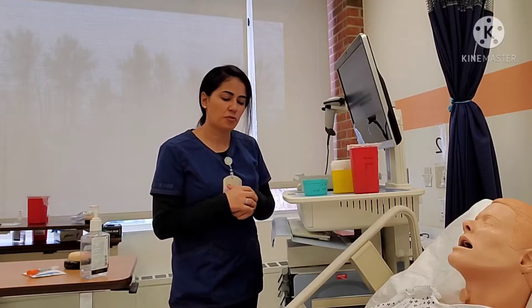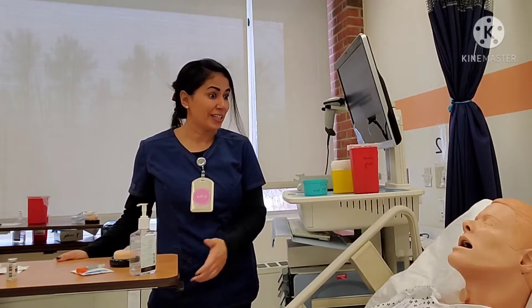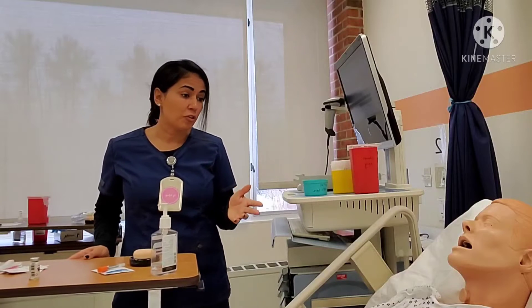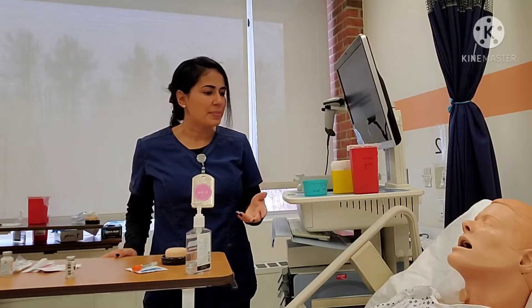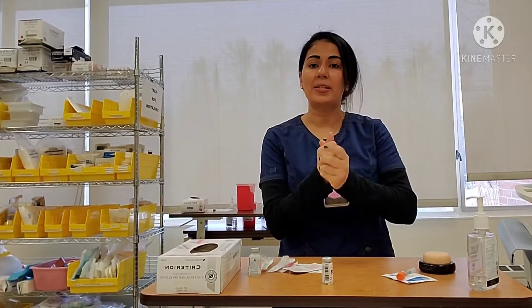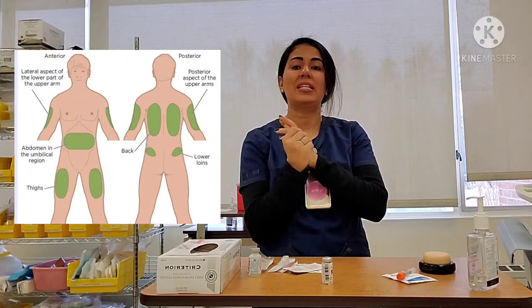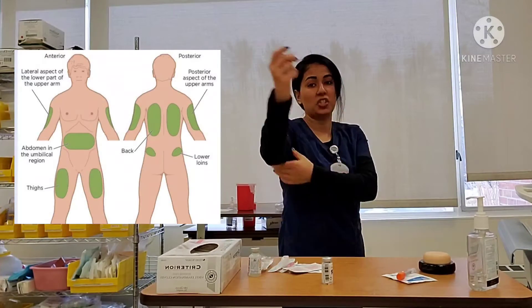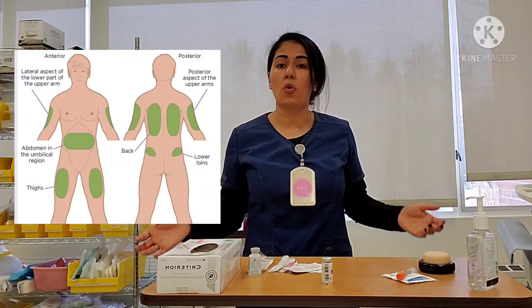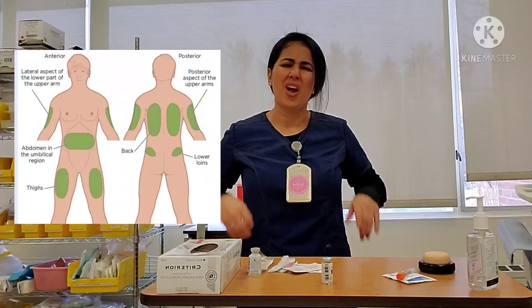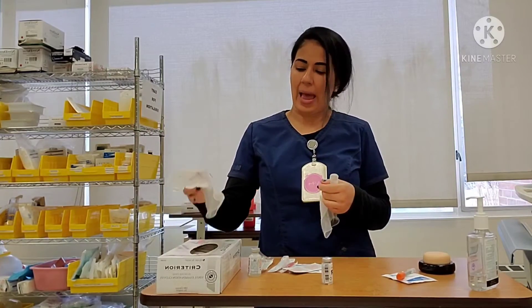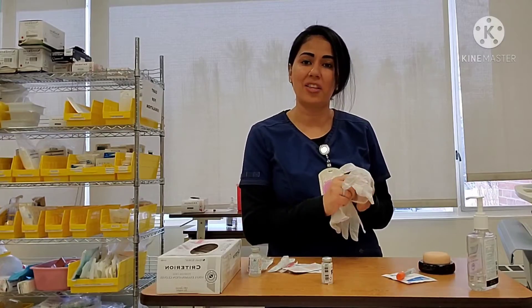I know you've had diabetes for a long time, so you probably know more than me. So I'm going to give you the four units of insulin — would you like it in the back of the arm or in the abdomen? The back of the arm? Okay. Remember that with insulin you can use any of the appropriate subcutaneous sites: the back of the arm — the fatty adipose tissue — the abdomen, two inches away from the umbilicus, and also the thighs and upper glutes, although those last two are not as common. Mostly we use the back of the arm and the abdomen.